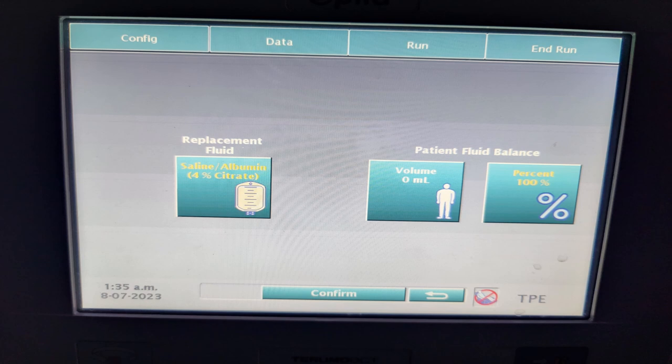Like any other plasma exchange, we have to provide the replacement fluid — saline albumin in this case — and set the fluid balance, which is 100% in this case.